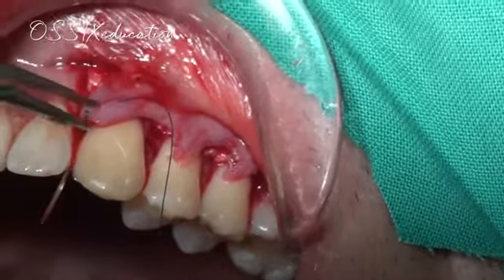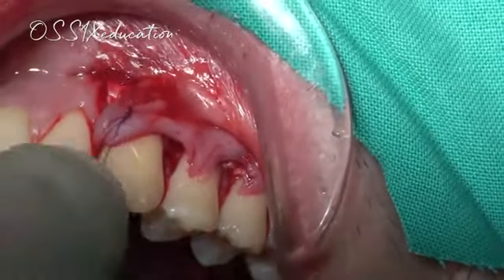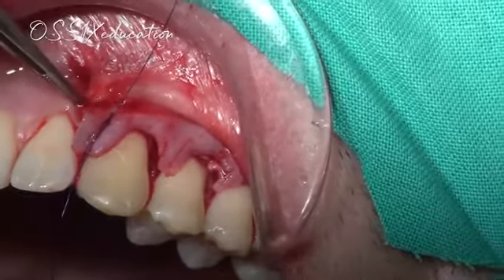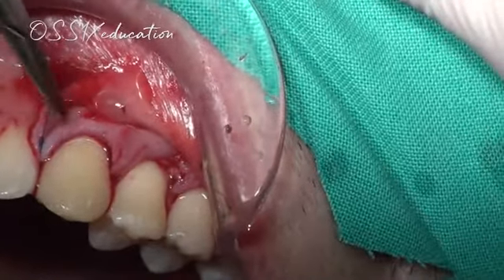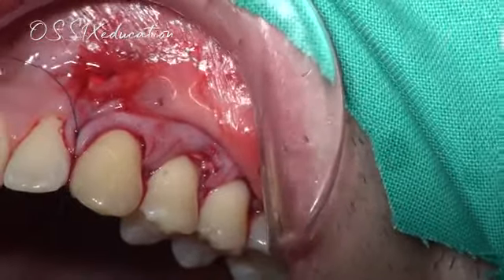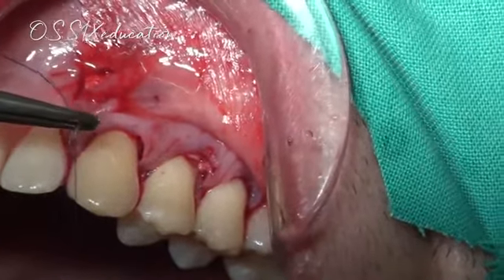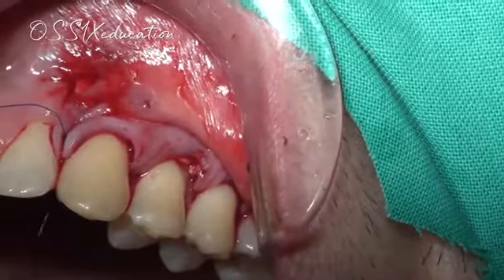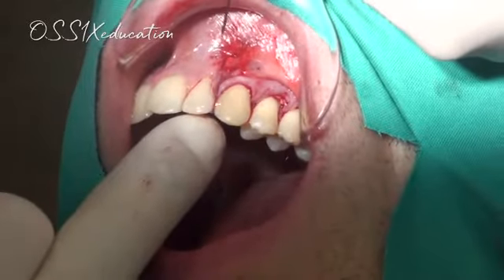We start suturing the papillae. I prefer to start from the mesial, from the canine. Sometimes I think that for me the 5-0 is a little bit better here. Now what I do in these cases, once I tie the knot here, I go again below the contact point and make a knot on the contact point to maintain this flap in a coronal position.